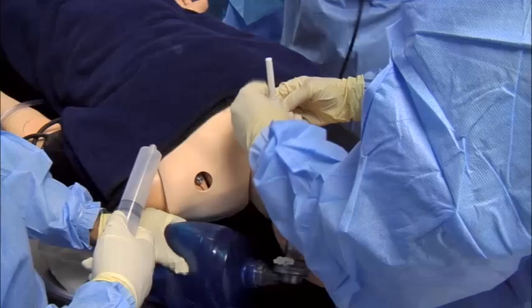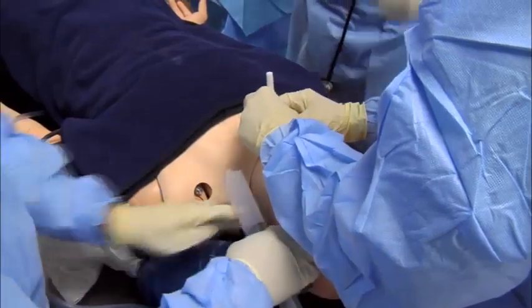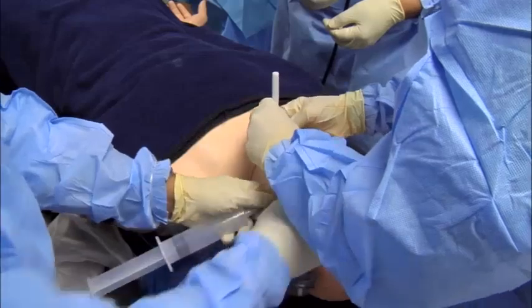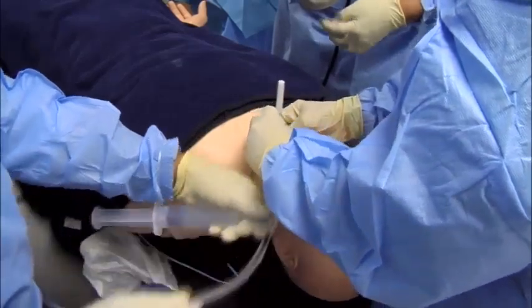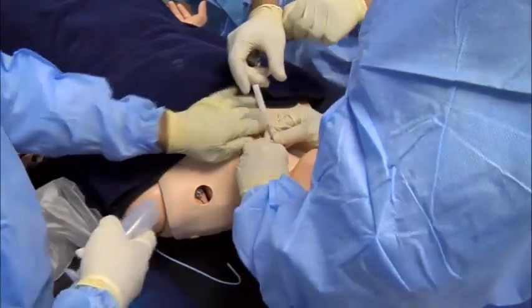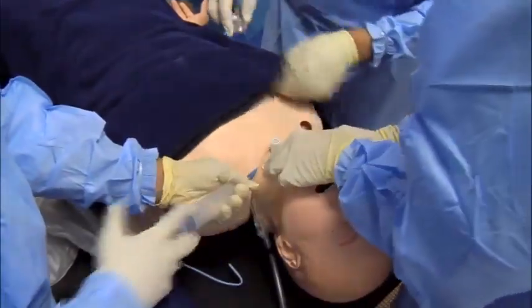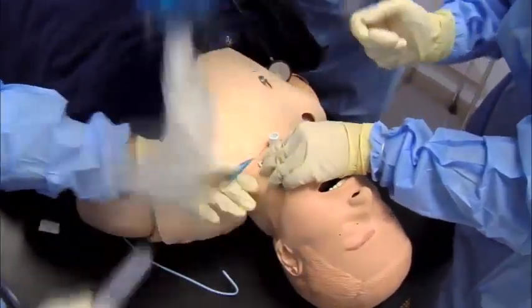Okay, let's slowly pull the ET tube as I'm introducing. Introduce it. There's the cuff up. Let's hook up the bag.